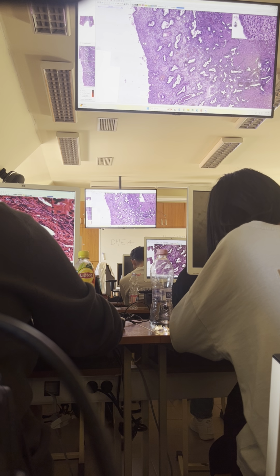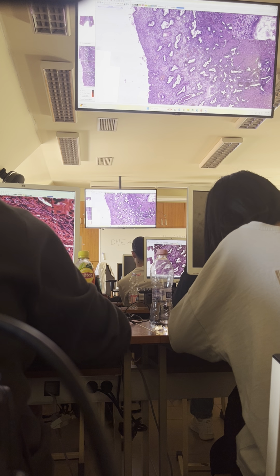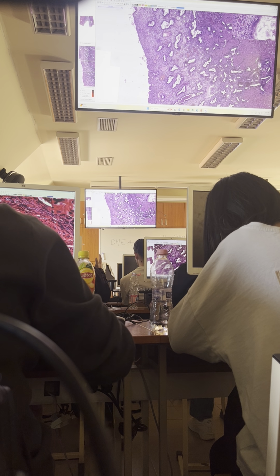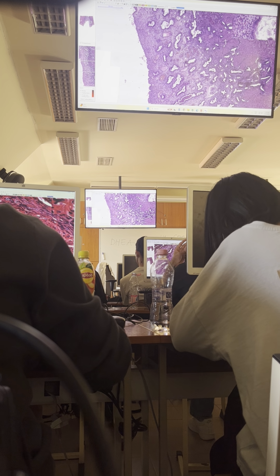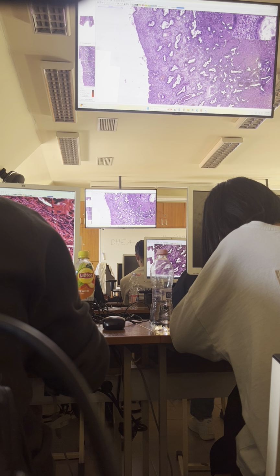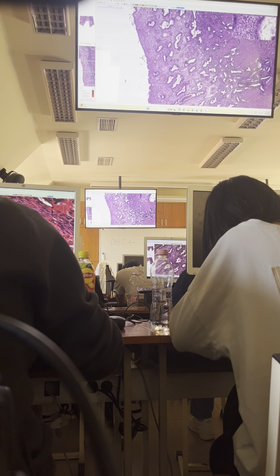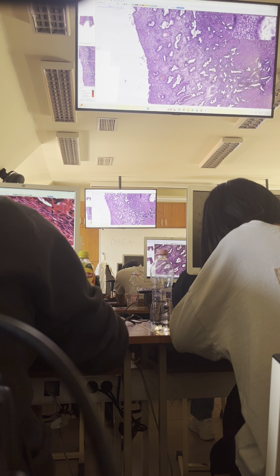So that's, yeah. But the shape of the gland, what you haven't mentioned. No, the gland, not the section. Yes, in the secretory phase, the lumen of glands gets more irregular, and also the secretum appears in large amount in the lumen in the secretory phase.